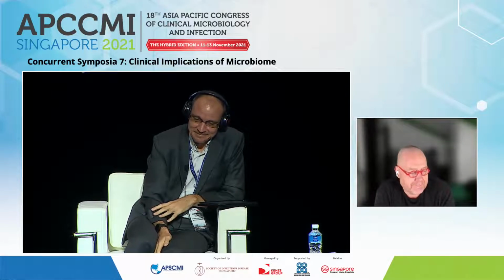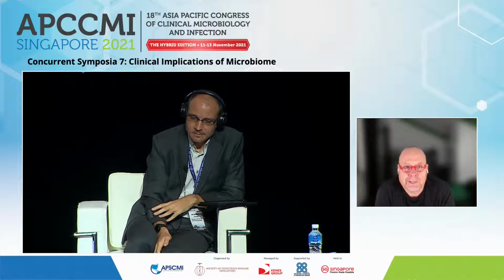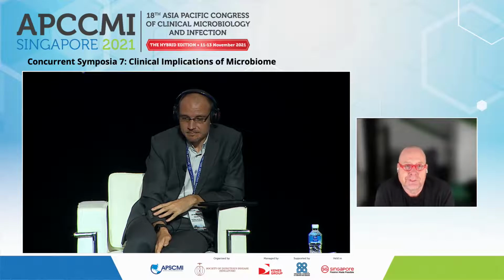For now, I think the biggest challenge is still mainly the turnaround times. Although we are getting results in 24 hours, which compared to bacterial culture can be faster, as I told you. On the other hand, I'm working in a hospital now, and we see COVID cases rising again, and on the emergency wards, they just want point of care testing devices that can give you a result already in 10 minutes.